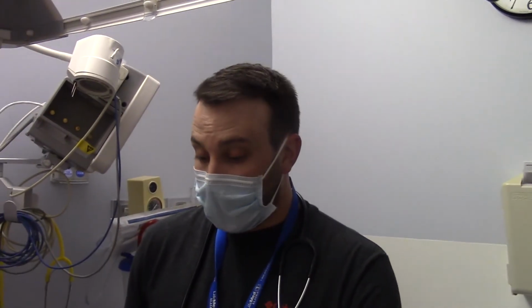Open communication being, hey, I'm going to go ahead, or did you by chance already get the OFC? Yeah, I did. It was 31. Awesome. So we're open communicating with each other, but we just closed the loop, and now we know that somebody is taking the OFC, we know the proper size, and we know that everybody is aware of it. What size mask are we using? What interface do you want to start with? Okay, we put it on at 4 o'clock in the afternoon. When do you want to change it? Well, let's change it 6 hours from now.